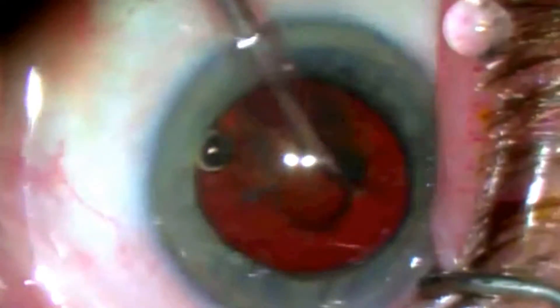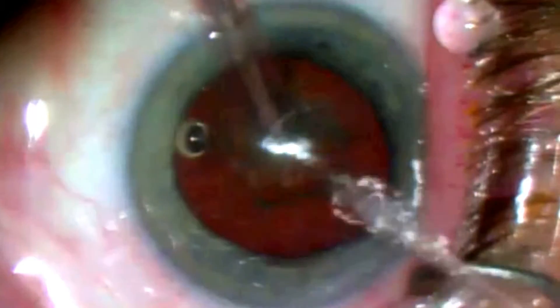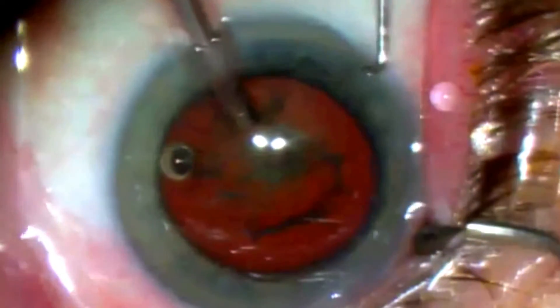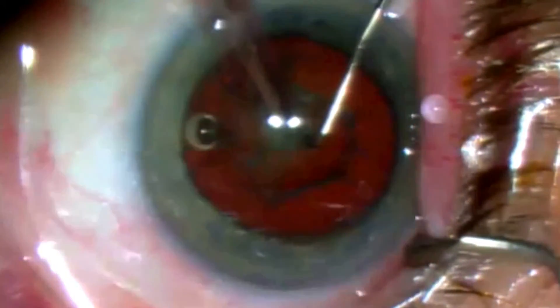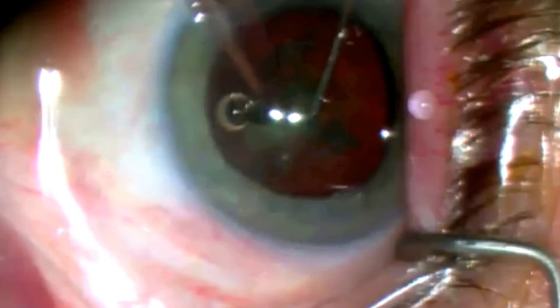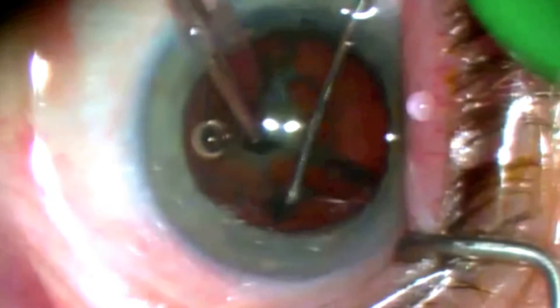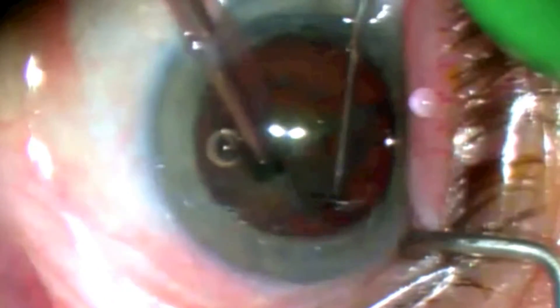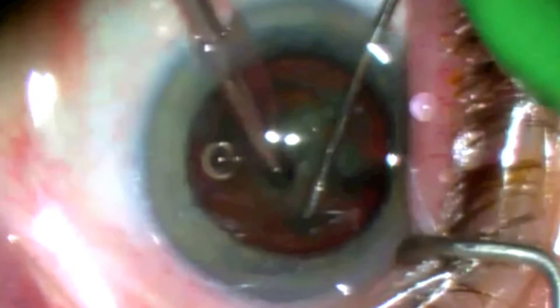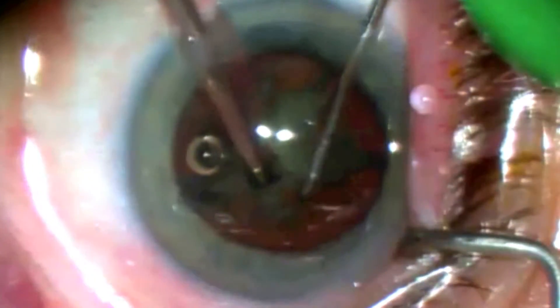Here we'll show two cases of more dense nuclei. This is a 3 plus nucleus, so we're going to tunnel in as deep as possible, down to the sleeve, to make sure we're deep in the lens — this will make it much easier to crack the lens down to the posterior plate. Often these denser lenses are more difficult to chop. So again we'll add high vacuum; you'll see the lens is able to be moved with the phaco tip, tugging towards it showing good purchase. Then we'll use the chopper to push down into the lens substance, get it in deep, and separate the two pieces. For subsequent pieces we're going to get good vacuum on each to ensure good purchase, going around about 60 degrees at a time. Once you have purchase, you just push the chopper down next to the phaco tip, chop, and then split the two pieces.